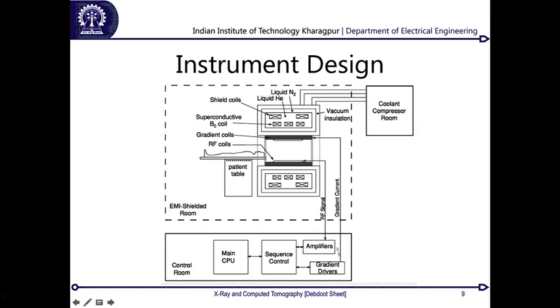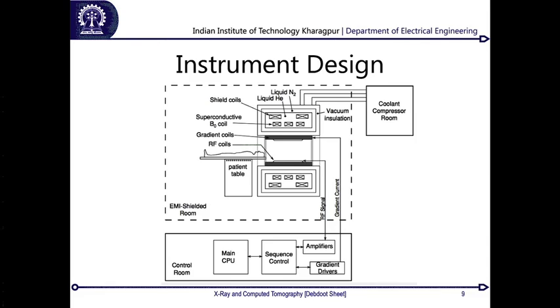And then the rest of it is basically a control sequence generator for the gradient pulses and the magnetic field gradients, and then a processing unit which has these band pass filters and their acquisitions from each of these, stacked onto a 3D volume. That is how an MR room looks.